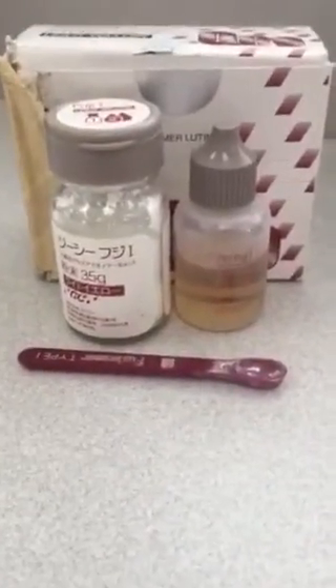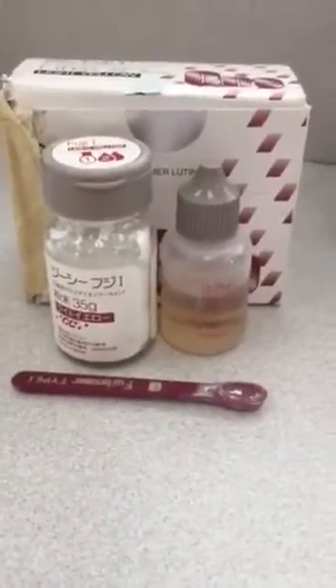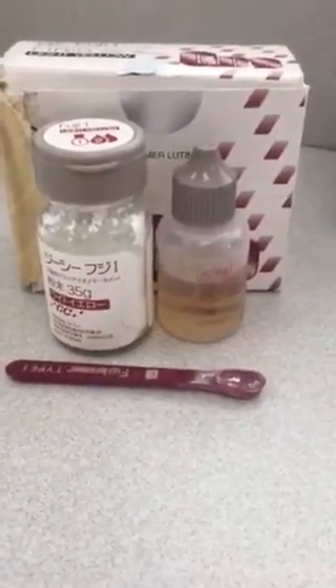This right here is the FUJI-1. You mix one scoop of powder to two drops of liquid, and you mix it on a paper pad or a glass slab for more working time.